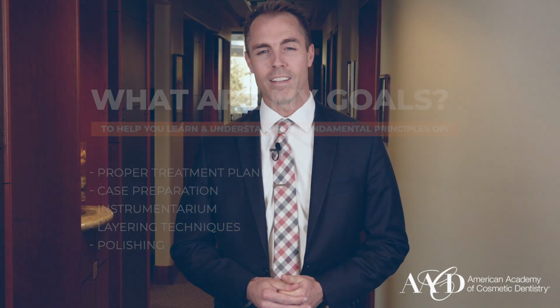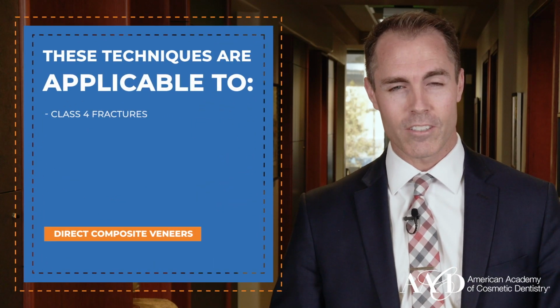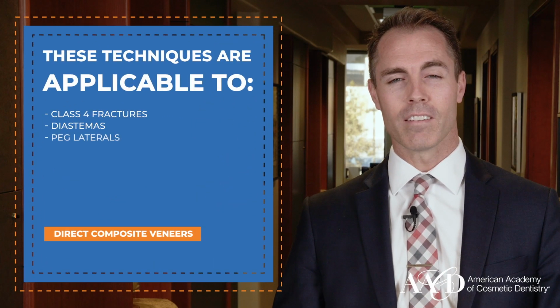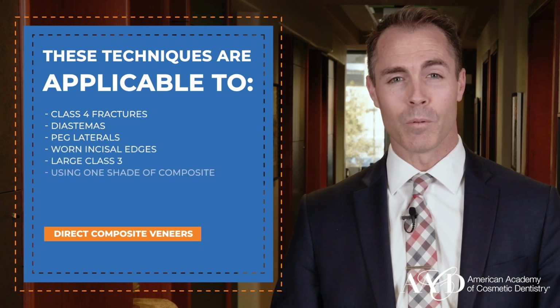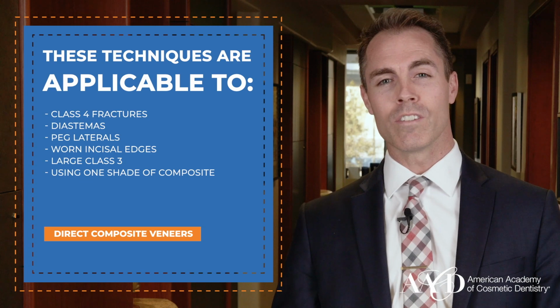The principles and techniques that will be presented in this video are applicable to every direct composite in the anterior segment, such as class 4 fractures, diastemas, peg laterals, worn incisal edges, large class 3s. It's even applicable if you are planning on only using one shade of composite. This kind of minimally invasive dentistry is becoming more popular and widely accepted by both dentists and patients, as materials and techniques lead to results that rival those of indirect porcelain restorations.